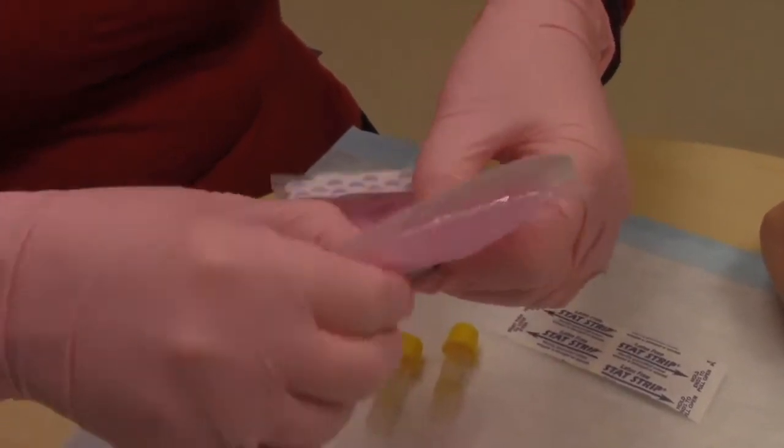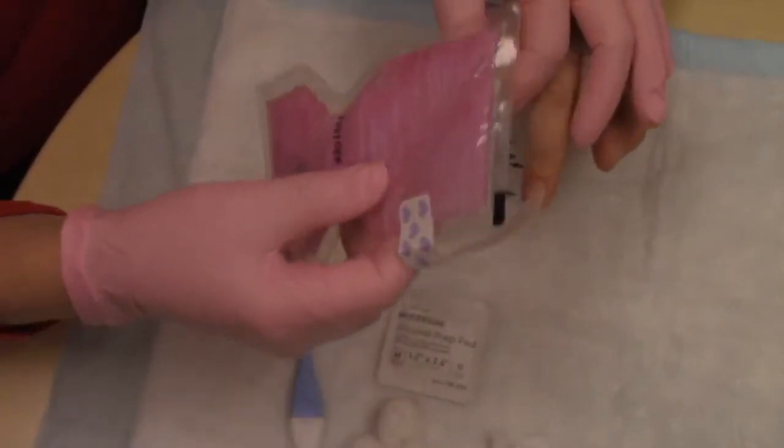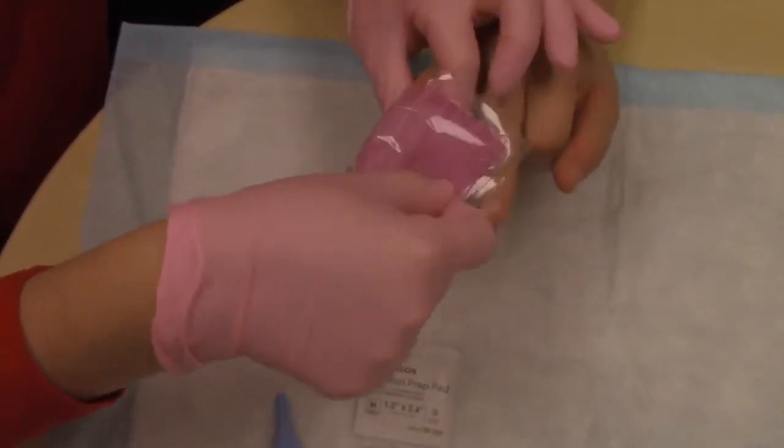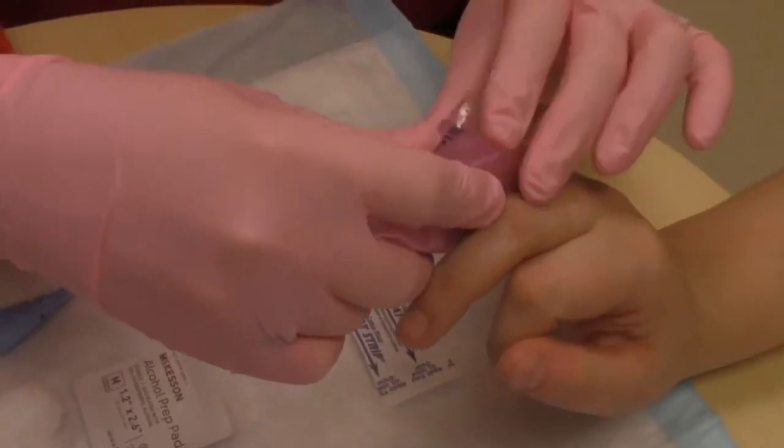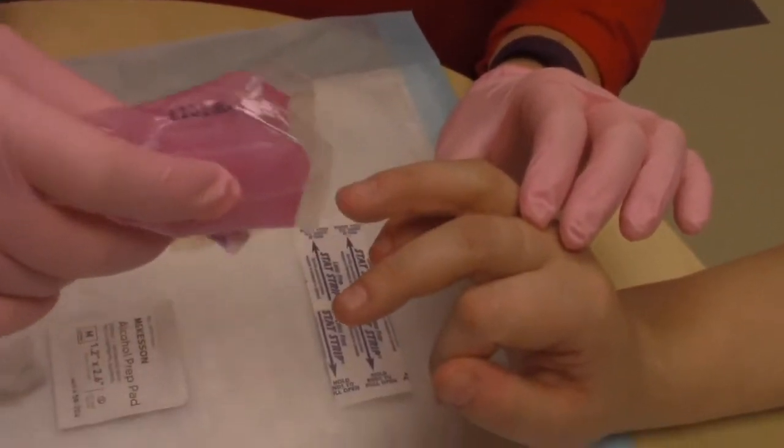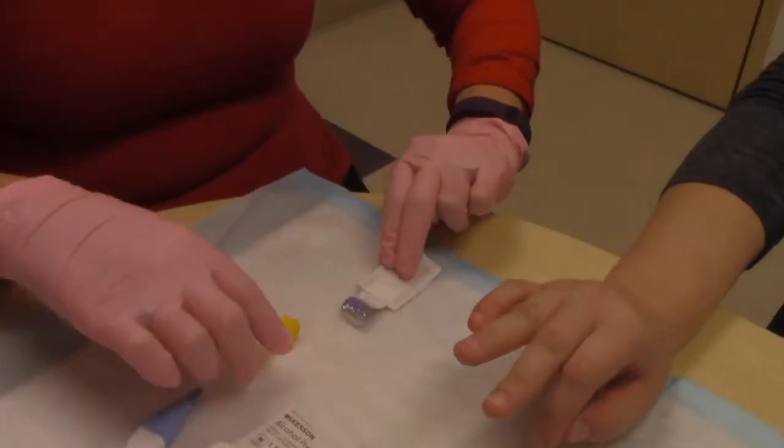Activate the warm pack and place it on the fingertip. Hold the warm pack on the fingertip for one to two minutes. Once the fingertip is warm, open the alcohol swab and clean the fingertip.